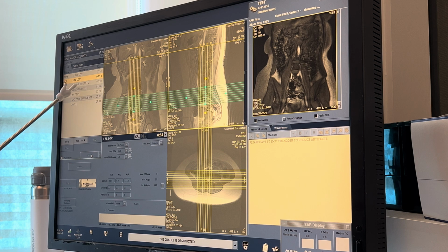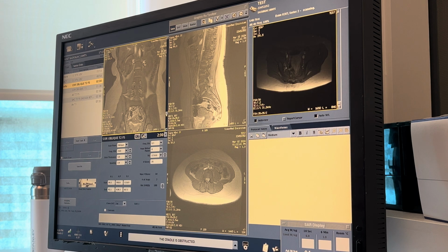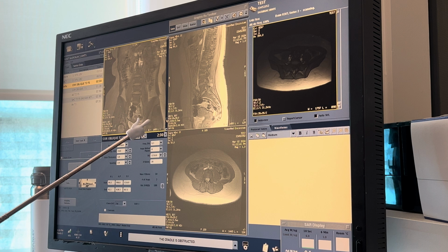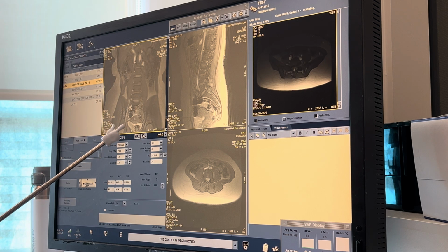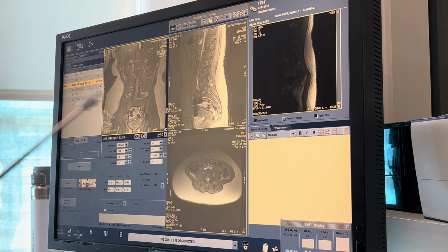Okay, so let's go into that coronal oblique, apply. Alright, so let's find our money slices, at least in this plane, and see if we have better visualization of the sacrum and coccyx over there, but this is a good slice. Not there, you can see the ilium all right there, but we lost the sacrum, so we lost the sacroiliac joint, so let's go up, keep going. Yeah, this may be our best slice. Let's go one more. That's a great one. Okay, we'll use that one.